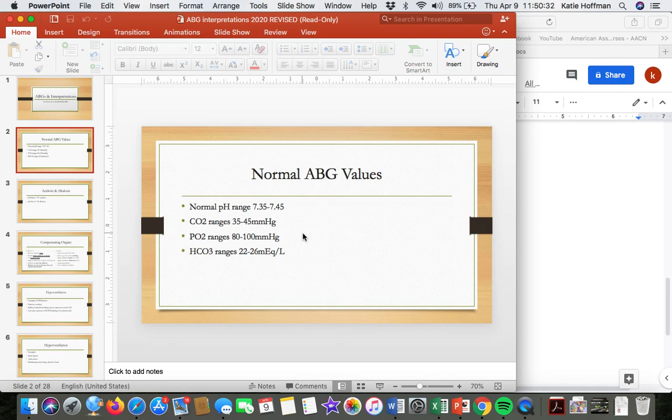When you have a patient who's ventilated, we will usually get a daily blood gas. And when I look at my ABGs, I like to interpret these every morning while I look at my labs. So the first thing you have to do is determine whether or not your patient is acidotic or alkalotic. So looking back at your pH range, acidotic is going to be a lower number.